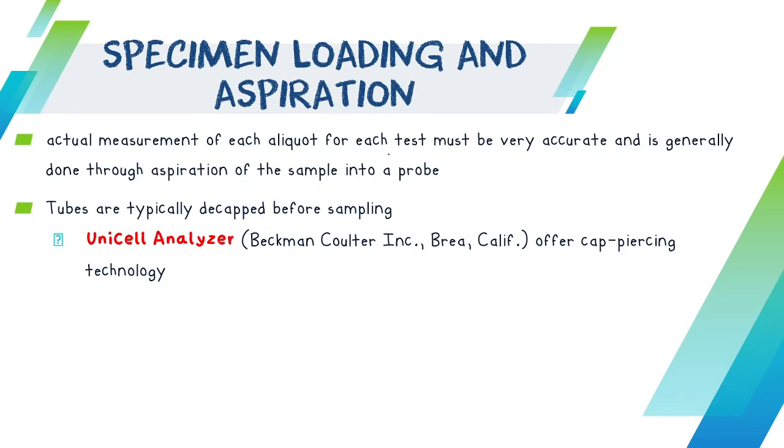Since kita kay modular integrated system lang man po jud ta, isa na sa hazard na ginabuhat sa chem, na syempre pag magdikap bya ta there could be aerosols or there could be spilling. Sometimes kung gahi jud kayo tanggalon ang inyong cap, then there could be spilling of your sample. So careful lang pag ana.